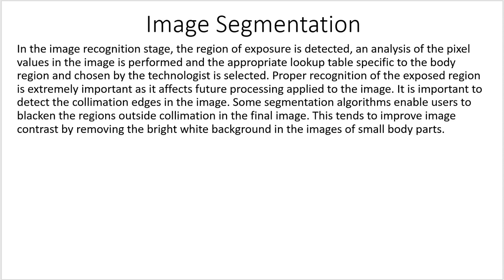It's important to detect the collimation edges in the image. Some segmentation algorithms enable users to blacken the regions outside the collimation in the final image. This tends to improve image contrast by removing the bright white background in the images of small body parts.